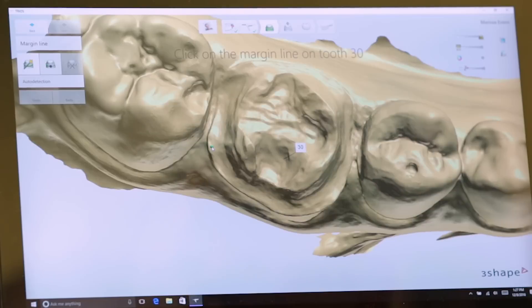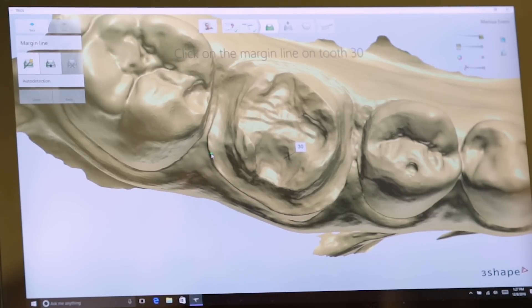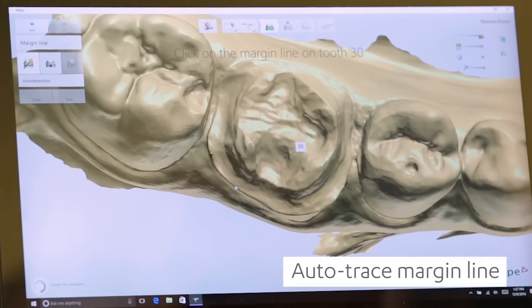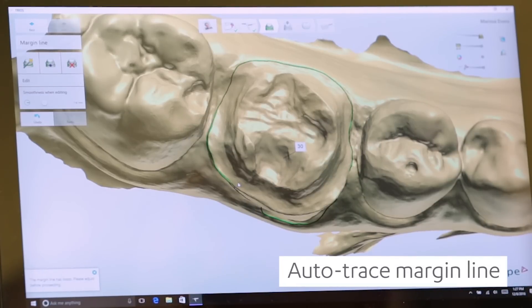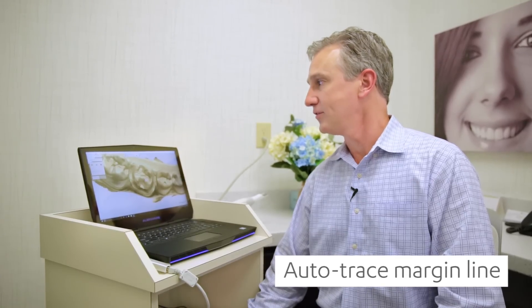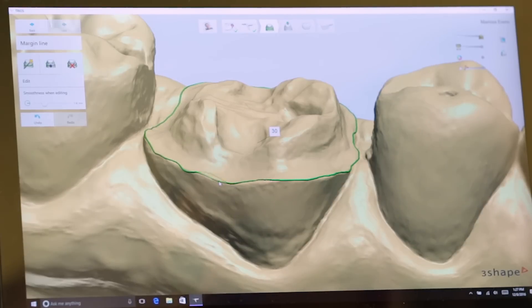This software plays perfectly from scanning to designing. We will trace our margin, and the nice thing is it does it for you. As we click on the margin, the computer will find it for you. There are some areas you may want to correct, and correction is very simple. You can see the margin is quite easy to find.